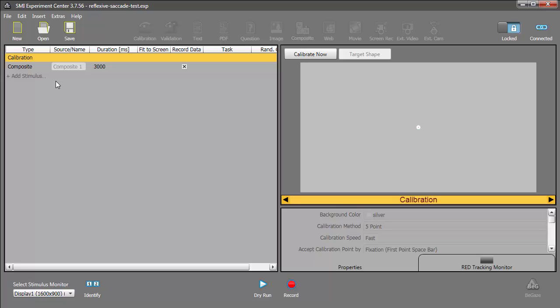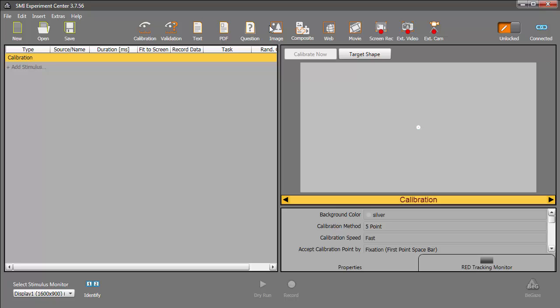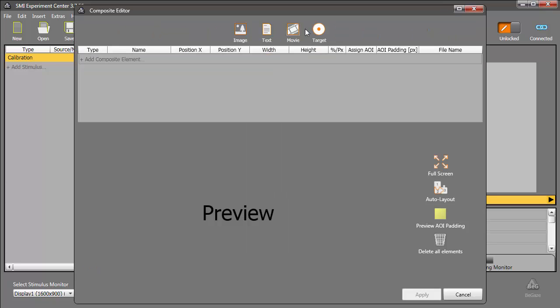The composite editor can also be used to create stimulus for a smooth pursuit paradigm. Let me show you how to build an experiment where the target moves in a horizontal sinusoidal pattern, so that the participant's smooth pursuit data can be tracked. This time, I'll make one composite stimulus that displays a fixation cross, and then another that uses a sinusoidal movement. I'll create a new experiment, and again open the composite editor.